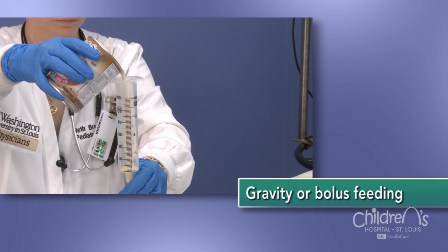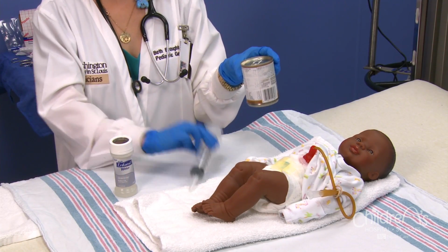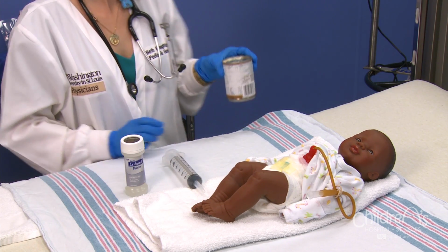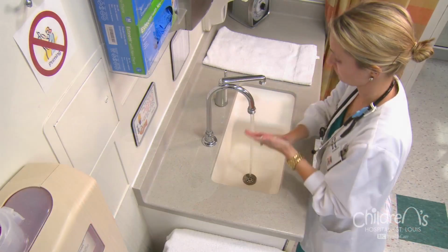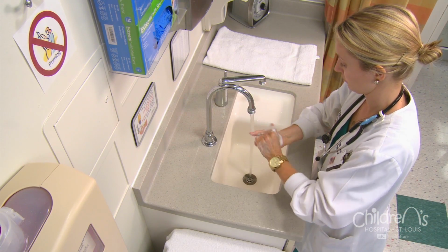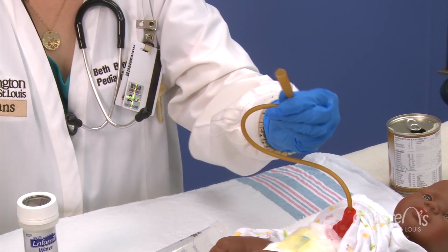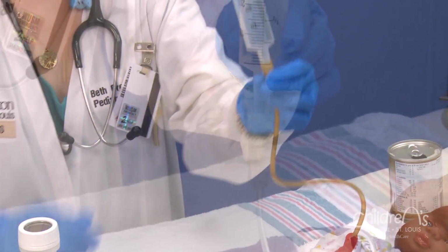To deliver a gravity feeding, which is also called a bolus feeding, assemble your supplies first. You'll need formula, a feeding syringe, and water for flushing. Once you've assembled your materials, follow these steps. Wash your hands. Remove the cap from your child's G-tube. If there is a rubber band in place, remove it at this time. Then attach the syringe to the tube.